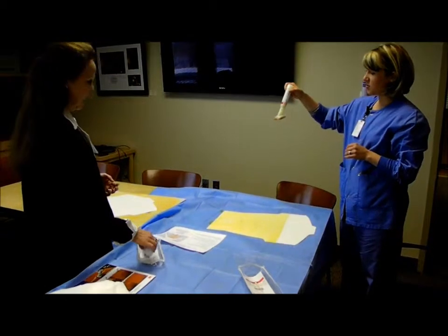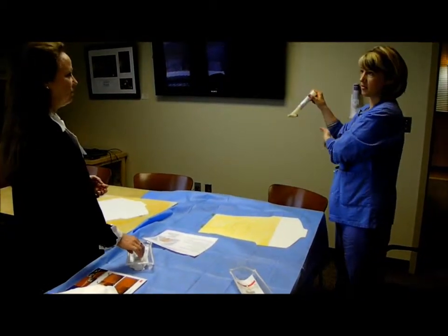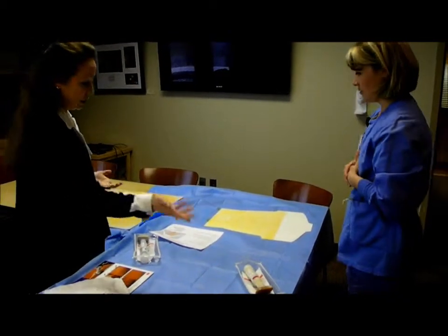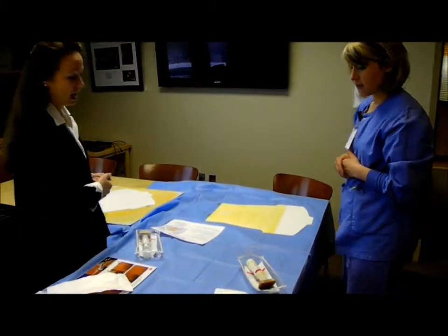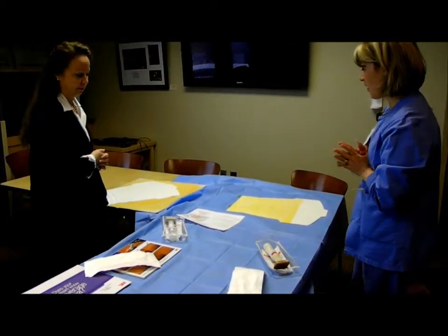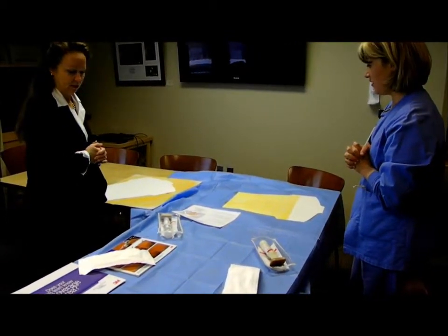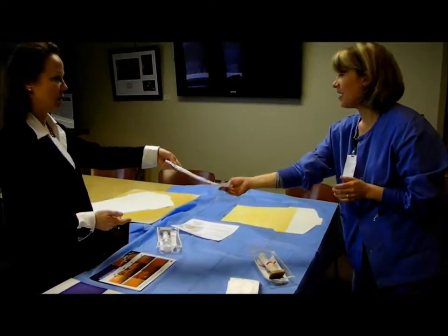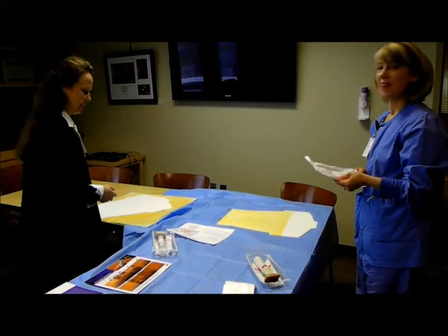Very good. And then the unused product, this can just get thrown away, right? Thrown away, yeah. It looks like you used about all of it. If you had extra, it's fine to discard it. You don't need to use all of it. Okay. Very good. Any questions? Do you want to take this with you? Yes, that would be great. Okay, perfect. Thank you.